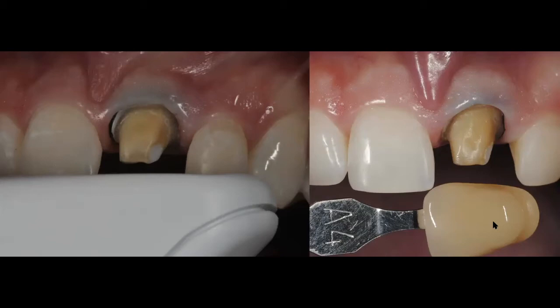And I think that we spoke a little bit about this at the beginning of our tips and tricks webinars, the importance of dental photography. Because today, a good lab technician will have right in front of them a huge monitor, a huge LCD, either monitor or TV, so that they can now download your photos. And the higher the quality of your photos, the best resolution, the better they're going to be able to see the photos right in front of them with their cast in their hand. So that now you are communicating with them, and you're letting them know, hey, by the way, underneath this PFM crown that this patient used to have, I have this substrate with this shade.